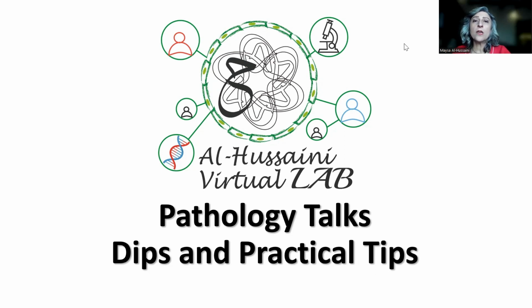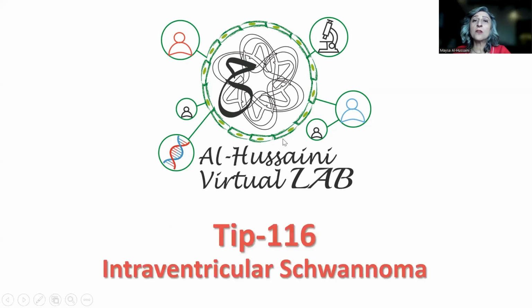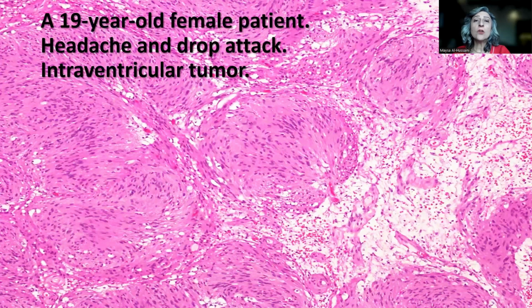What I'm going to be sharing with you today is a nice example of a rare tumor, intraventricular schwannoma. This is a case of a 19-year-old female patient who presented with headache and drop attack, and then she underwent a brain MRI examination and was found to have an intraventricular tumor that was thought to be something like a neurocytoma. Now, the tumor was excised and sent for pathological examination.